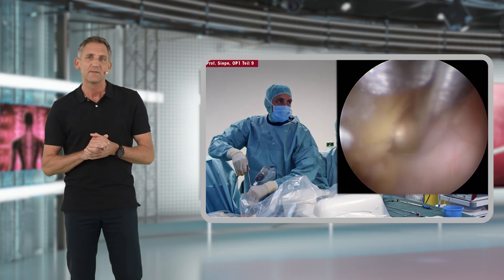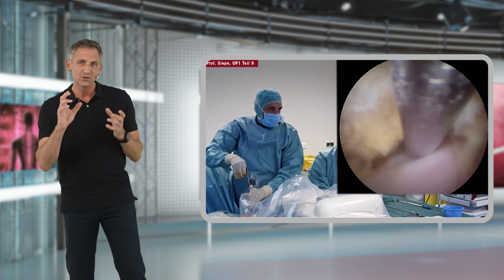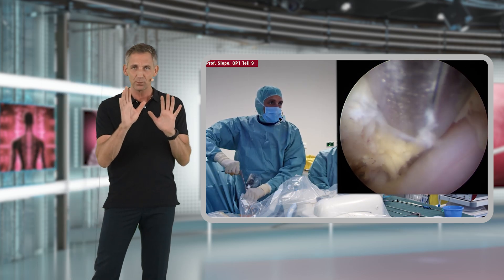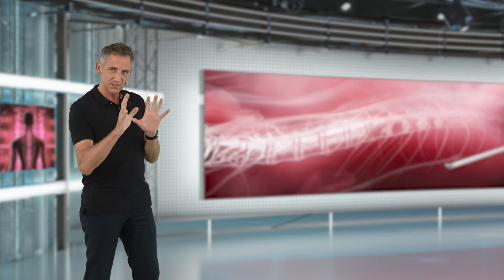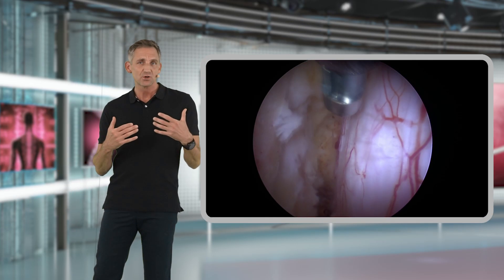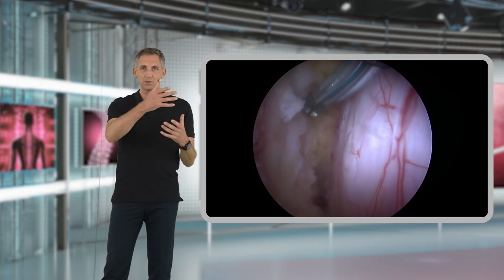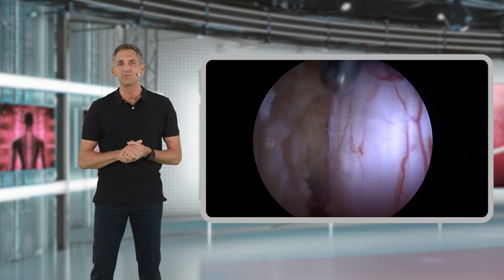Make sure that once you have reached the contralateral recess, you do not accidentally put any pressure with the Kerisson rongeurs on the contralaterally exiting nerve root. This is especially important for beginners — be careful not to squeeze down with the instruments on the contralateral nerve. Repeat these steps until you can fully confirm that the contralateral neural structures have been fully decompressed.